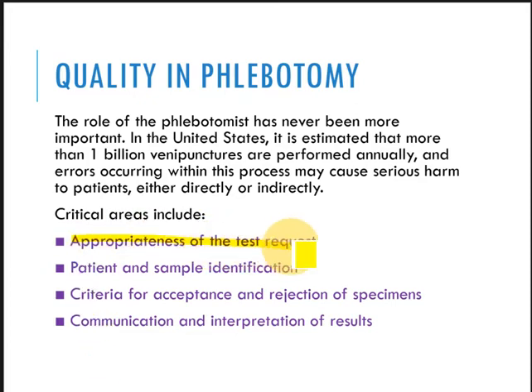Appropriateness of the test request. We have patient and sample identification, criteria for acceptance and rejection of specimens, and lastly, communication and interpretation of results. Now, firstly, guys, appropriateness of the test request. So we have to make sure that the doctor's request is the same as the laboratory request.